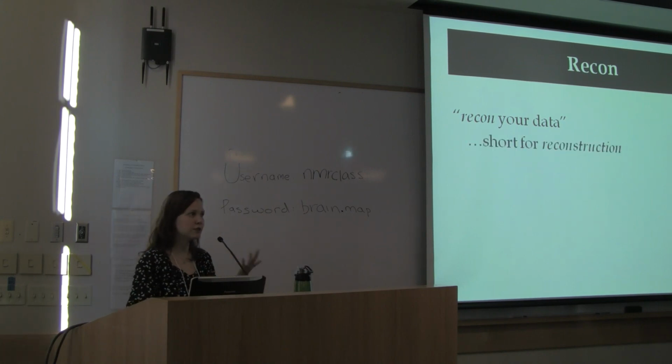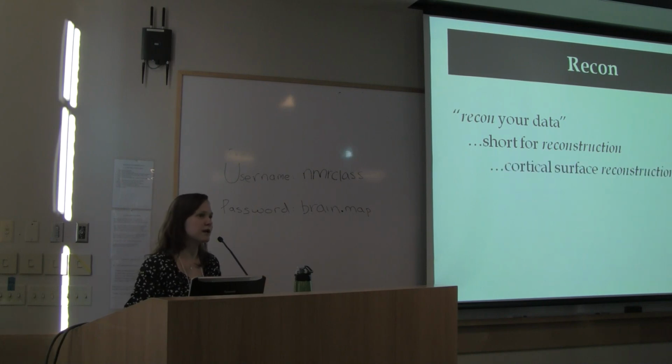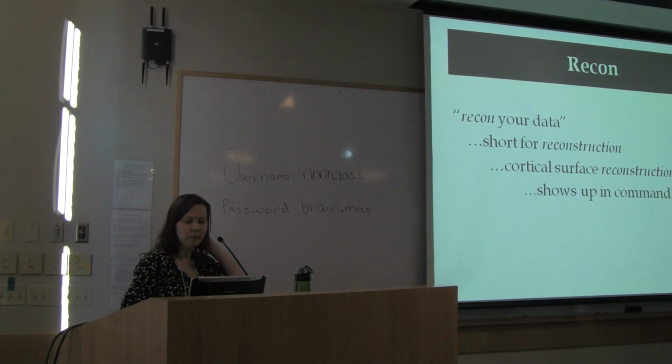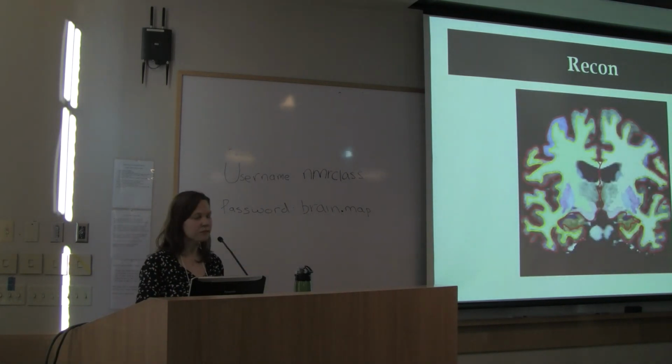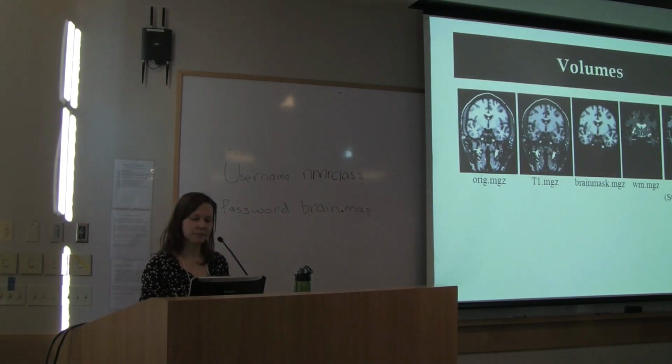It's short for reconstruction, so it's the cortical surface reconstruction that we're doing. And we just shorten it to recon. You'll hear us throw that term around a lot. Also, the command that runs FreeSurfer is recon-all. And what that's really saying is recon everything, run all the steps, do everything all in one shot. And that's what it looks like.